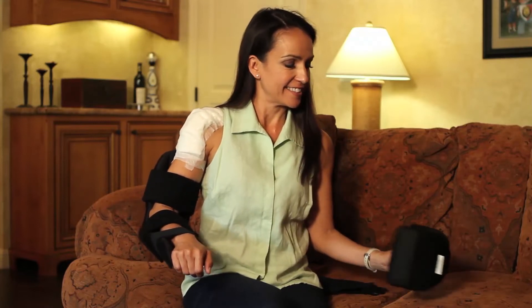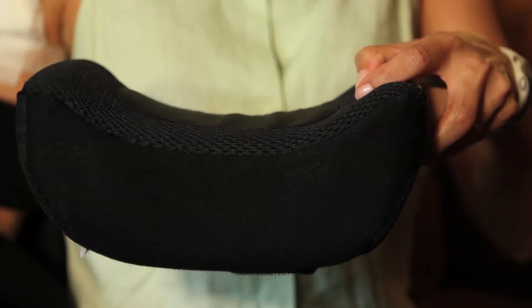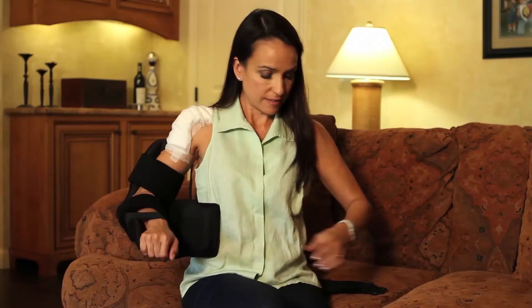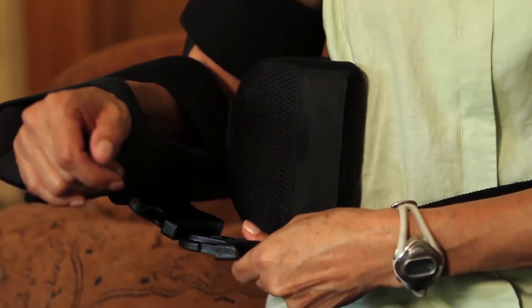The hip bolster may then be placed with the curved surface against the body. The velcro square on the back side should be positioned so that it attaches to the lower arm strap on the side of the brace. The waistband is then brought around and buckled on the underside of the cradle.